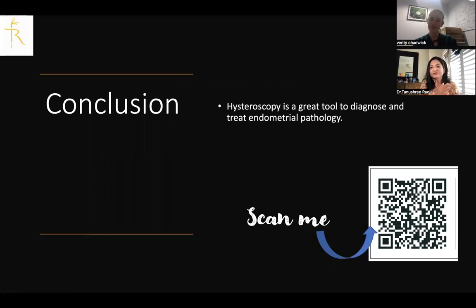So look, these were the videos that I had to share, and essentially, hysteroscopy is a great tool, is what I feel. I would never hesitate to offer a hysteroscopy if needed. I am aware that there are a few other outpatient ways that you can sample the endometrium. You can just do an endometrial pipelle biopsy, which can be done in certain cases. You just have to pick and choose, because whatever is said and done, the gold standard is to actually visualize the endometrium for yourself and take hysteroscopic guided samples. I do have examples where the pipelle has come back as simple hyperplasia, and then you do a hysteroscopic guided biopsy and pick up the cancer in it.